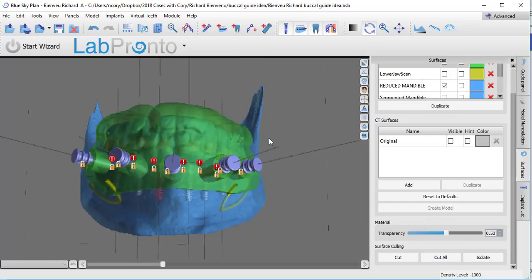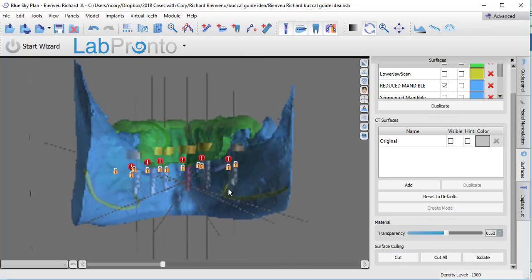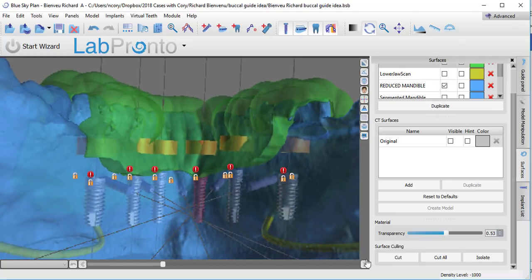I'm going to remove that, and instead I'll look at it from the lingual. It's very important that you do this from the lingual. I'll zoom in pretty tight. And our cuts need to be made between the head of the implant and the bottom of the guide tube, okay? Because obviously you need your guide tube sitting up above the bone, but your implants you still want to keep a little bit subcrestal, so we'll make the cut right in between those. So now come to cut all, and remember it's going to cut whatever surfaces you have visible here. So I'll come in and go right in between these two. Not worrying too much about the neighbor.